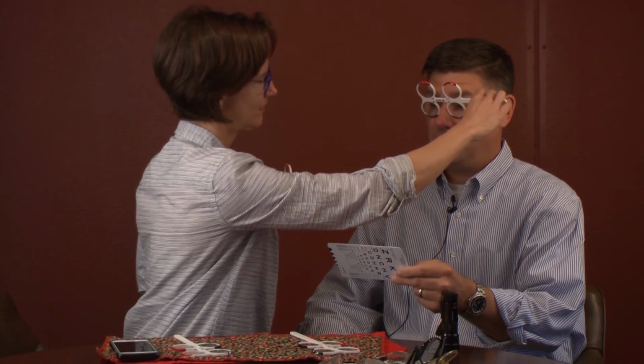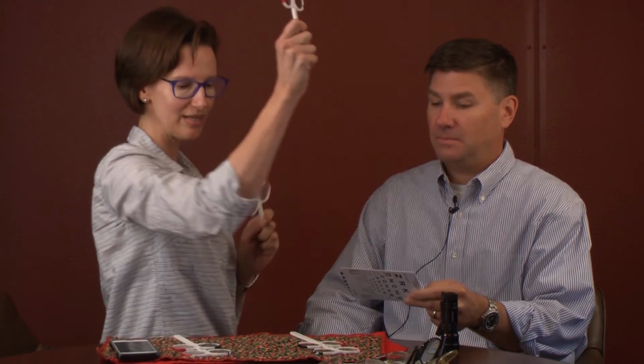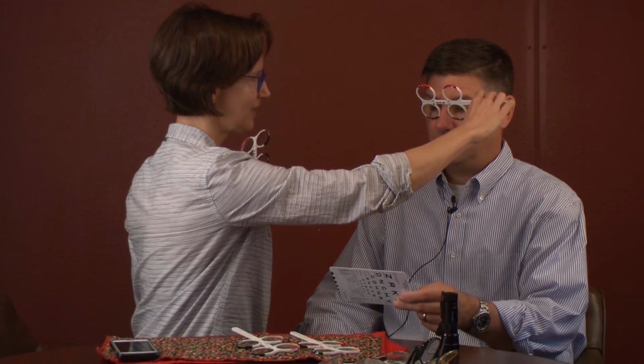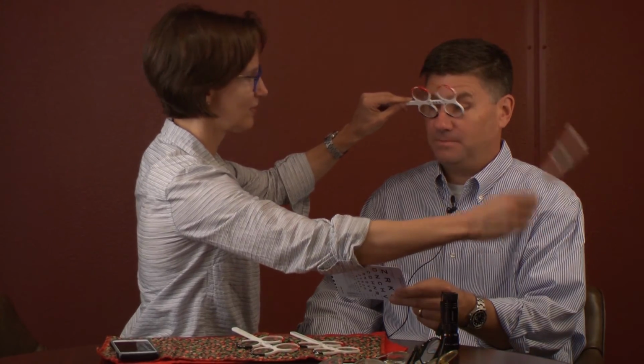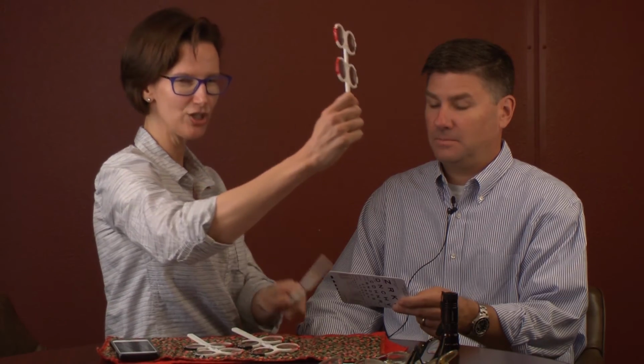Is it better with this lens or better with this lens? About the same. Okay, that's okay. We'll keep going then. So I'm going to keep the 3 in my hand. I'm going to put down the 2. I'm going to grab the 4. We'll look at the 3. Look at the 4. Oh, 3. The 3. So we'll go back to the 3. And so we'll fine tune that a little bit.